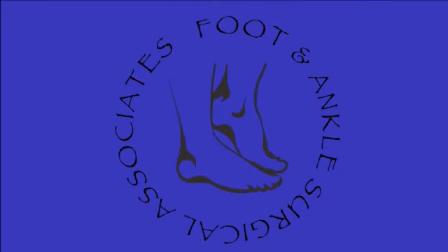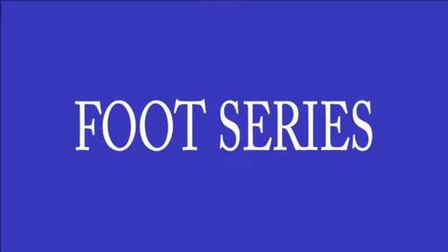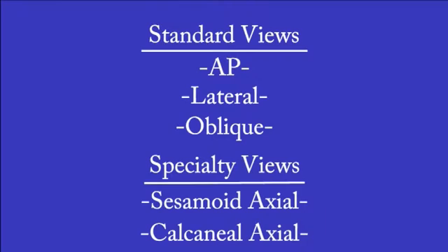As a podiatry office, our main focus is the foot and ankle. So the main views you will be taking are going to be the foot series and the ankle series. For the foot series, there are 5 basic views you will need to know when taking X-rays. 3 of the views are standard for any foot films and for any patient. These 3 views are the AP, lateral, and oblique views of the foot. The other 2 views are specialty views and are indicated only when the chief complaint is a specific concern or when the physician tells you to take the specific view.